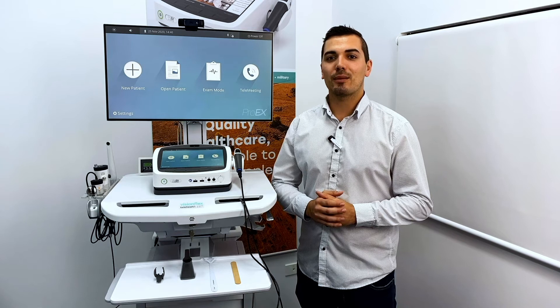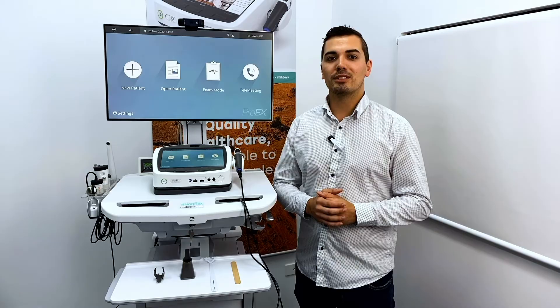Hi, I'm Alex and today I'd like to introduce you to the three accessories you can use in conjunction with your GEIS general examination camera. The GEIS camera can be used with a tongue depressor, a wound measurement stick, and a dermatology hood.